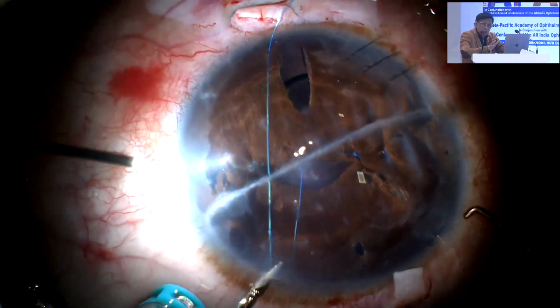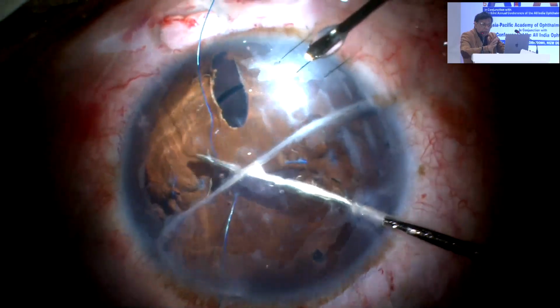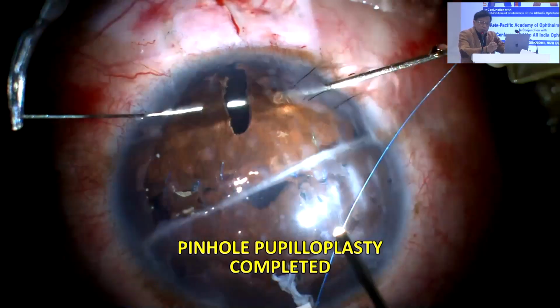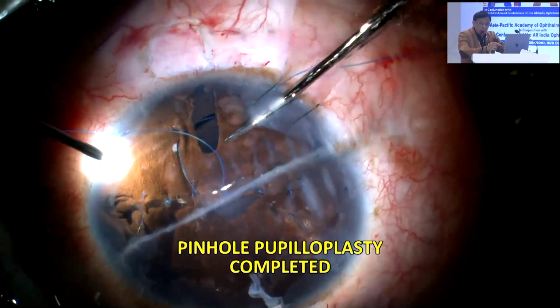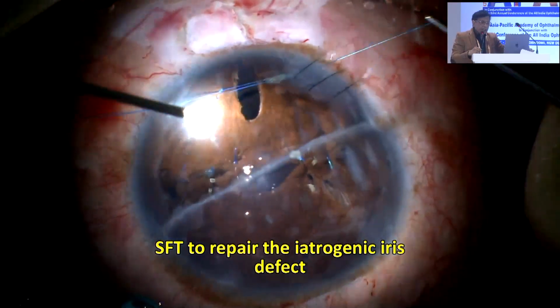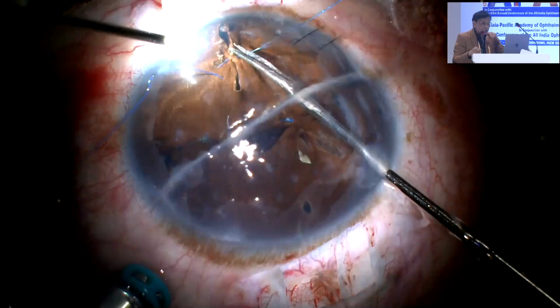All your phaco machines have got very good vitrectomy probes. I tend to use the posterior vitrectomy system, being a retina person, but you can always use your phaco vitrectomy machines also with it. That small peripheral iridectomy had become large because I have pulled on that iris. That also gets closed because I don't want this patient to have any polycoria, things like that.